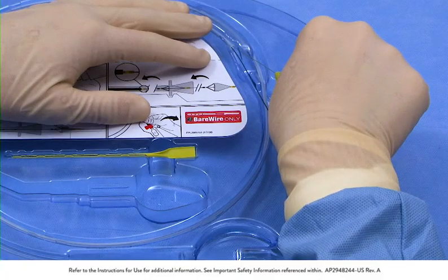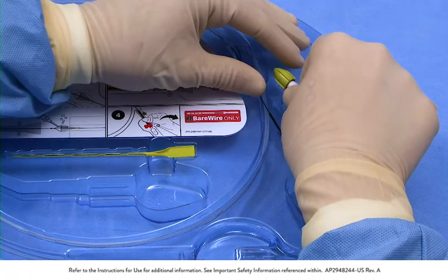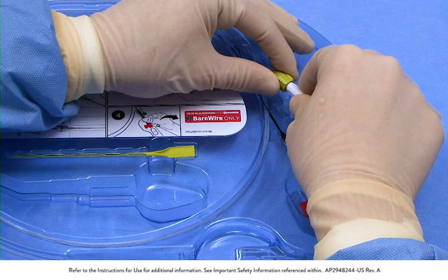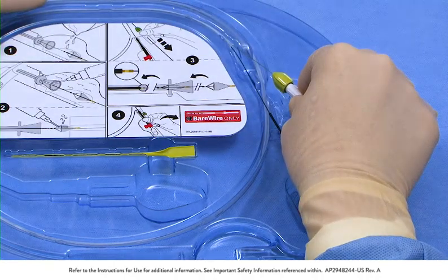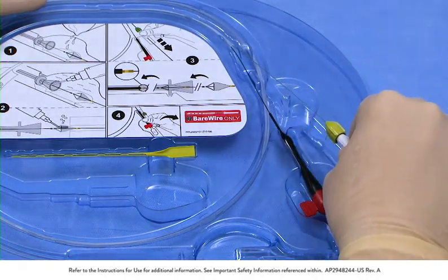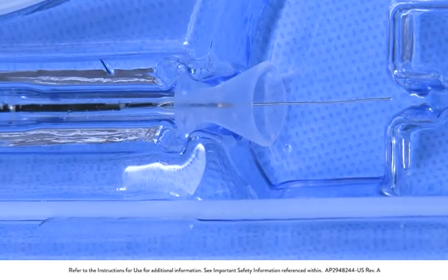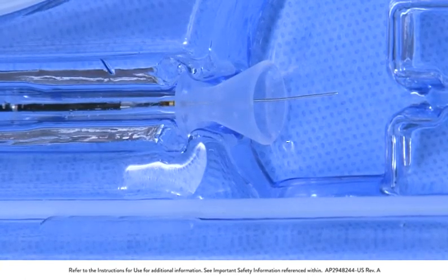Unclip the torque device. Check that the torque device is securely tightened on the coating-free section of the bare wire. In a controlled manner, carefully pull the torque device to retract the bare wire. Observe the filtration element being retracted through the loading funnel into the delivery catheter pod.